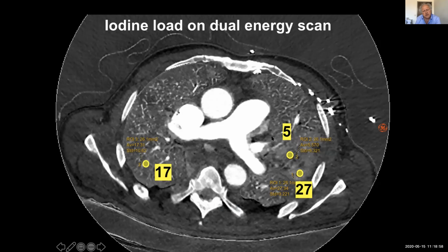And then you see in this zone where you had the ground glass that the iodine coming in is really low. Normally it should be between 17 and 20. In this zone, the iodine level is going high because this is inflammation. But probably in this region here, all small vessels are occluded and we can't see it macroscopically, but we know that iodine is not going to that tissue.